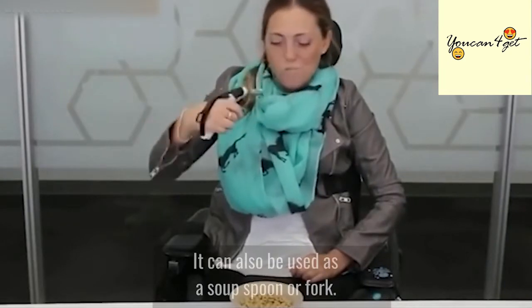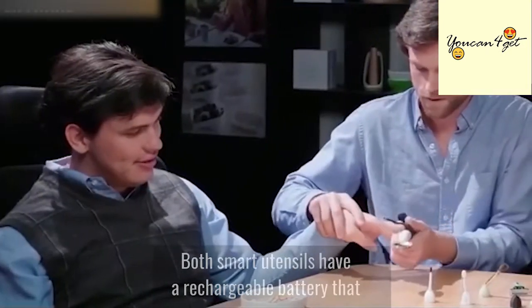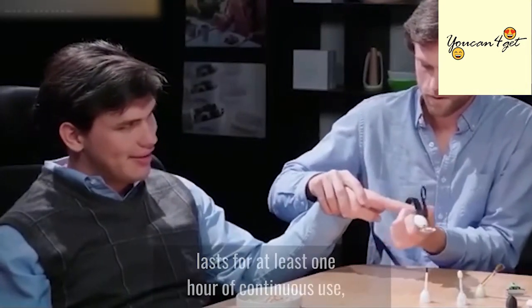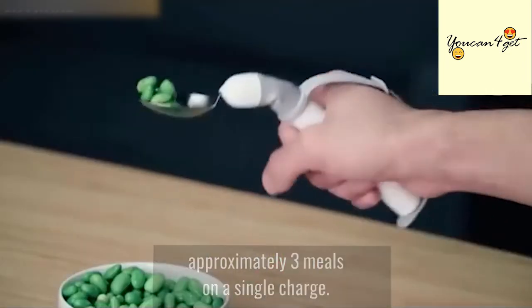It can also be used as a soup spoon or fork. Both smart utensils have a rechargeable battery that lasts for at least one hour of continuous use, which is approximately three meals on a single charge.